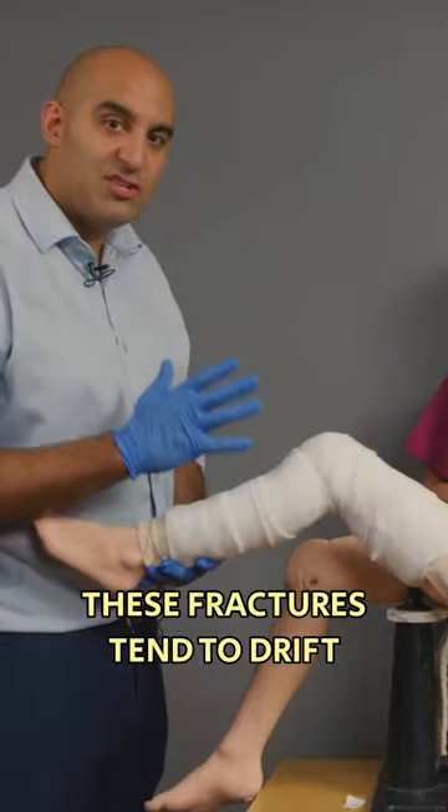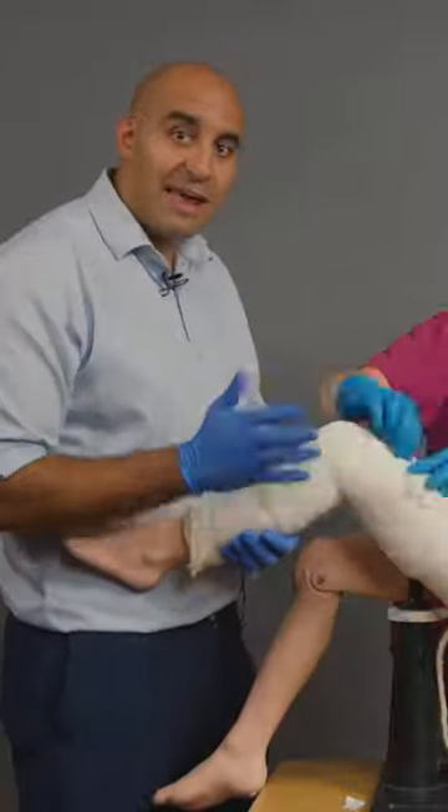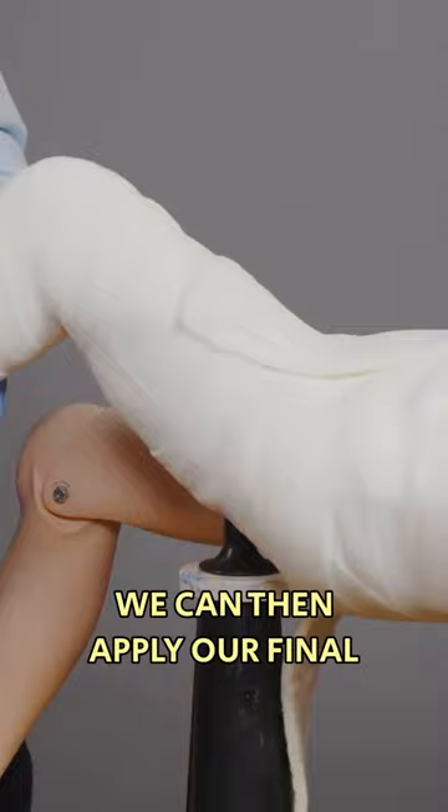These fractures tend to drift into varus. We've got our moulding, we've got our reinforcement. We can then apply our final layer of scotch cast.